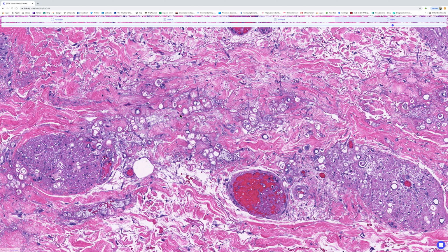And what is really striking as well is the virtual absence of any inflammatory response whatsoever. And this is what you expect to see in patients suffering from systemic intravascular fungal infections.